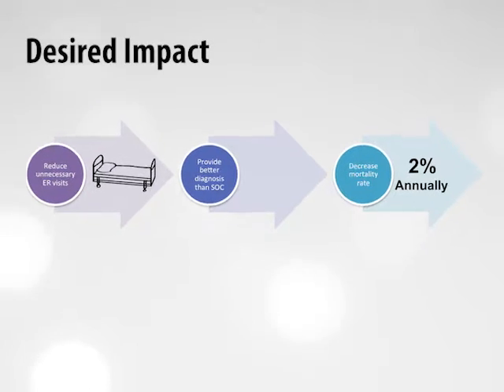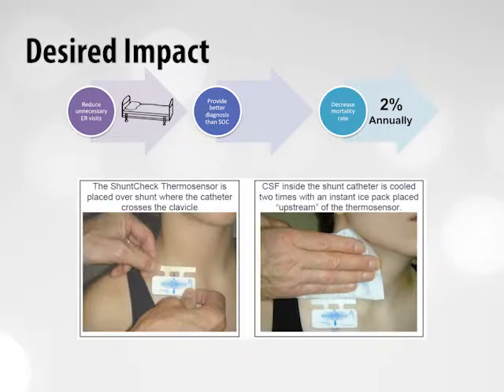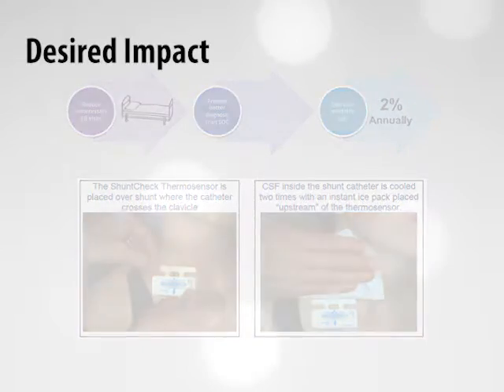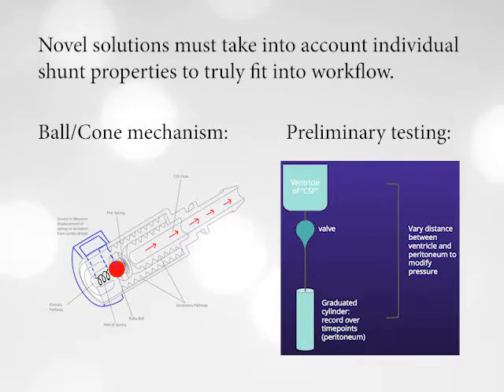One such popular technology that neurosurgeons often rely on is shunt check, which relies on the principles of flow thermodilution to externally diagnose if a shunt has adequate flow or not. The ultimate problem with solutions like this is that they still incur ER admission costs and don't take into account the flow rates of patients present while shunt function is normal. Therefore, a truly novel solution to hydrocephalus must take into account the non-uniformity of CSF drainage to determine if shunts need to be replaced based on each individual patient's normalized flow rate.